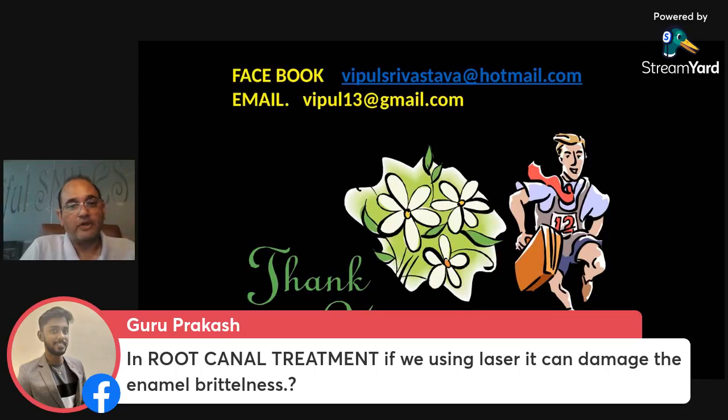No. First of all, in root canal, when I'm inside the root canal, there is only cementum, not enamel. Enamel is the outer coverage only on the crown. Lower down it is cementum or dentin, right? So we are into the dentin. When we are into dentin, there are two ways to use your diode laser, one is the wet environment, another one is the dry environment. We are using it at a wattage of 1 watt, and 1 watt has no effect on hard tissue. Anyway, a soft tissue laser has no effect at all on hard tissue. So don't worry about it. I will definitely be discussing root canal treatment again in my next webinar series.